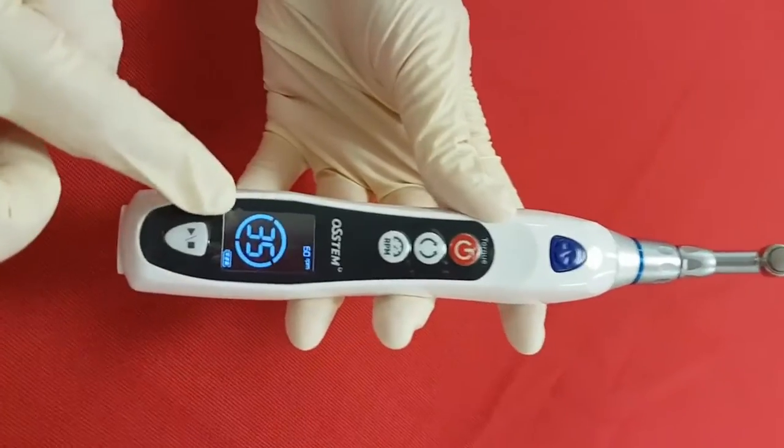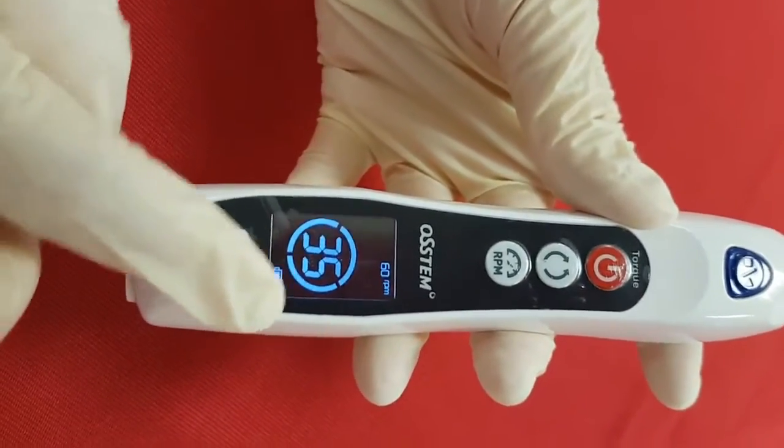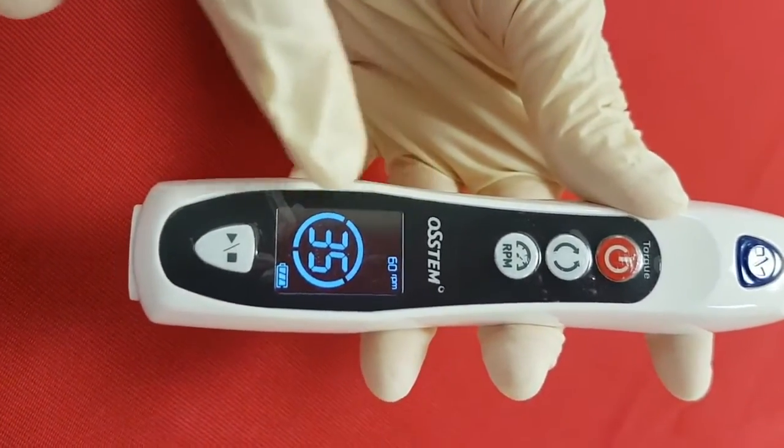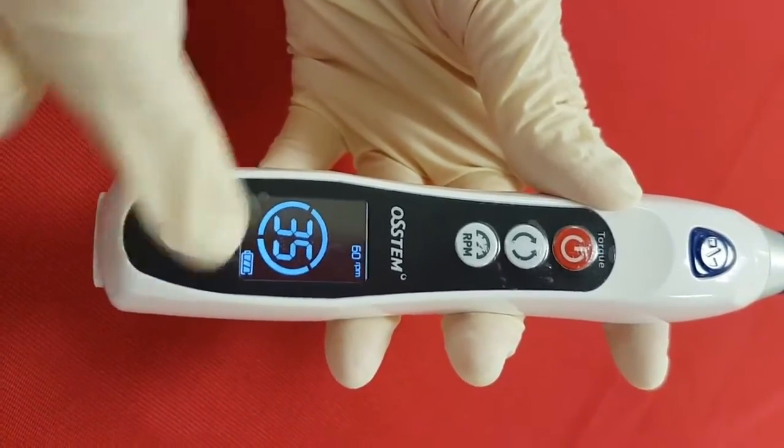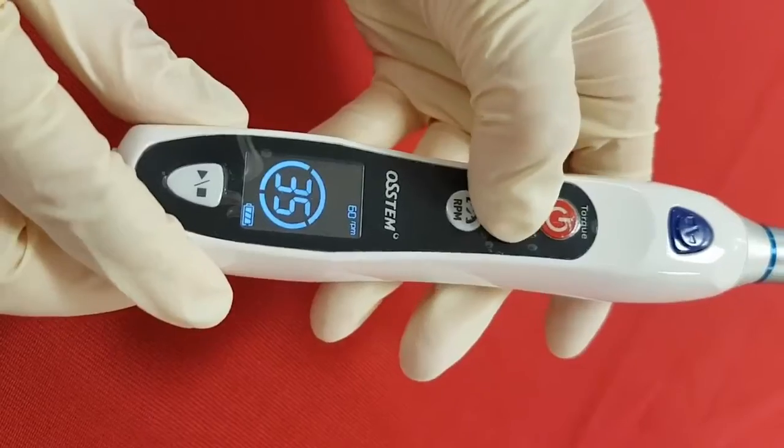The LCD panel displays the current status and operation mode. You can check information including speed, setting torque value, real-time torque value, battery status, and direction.